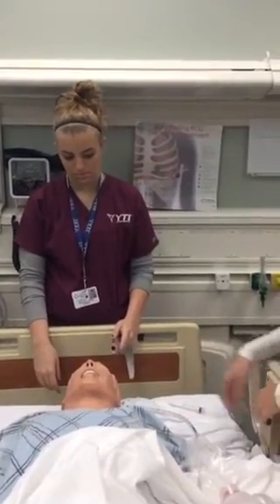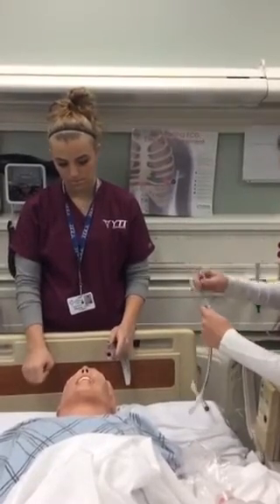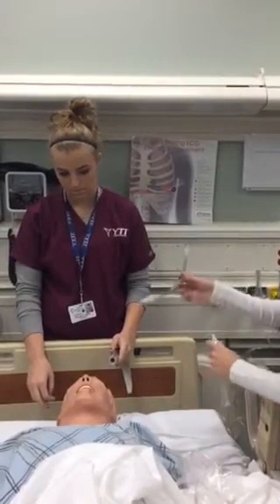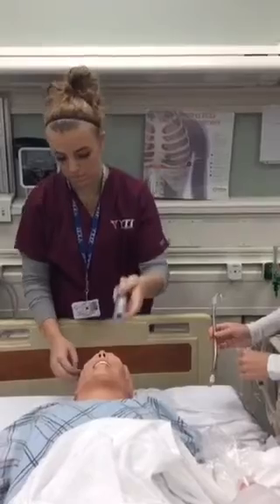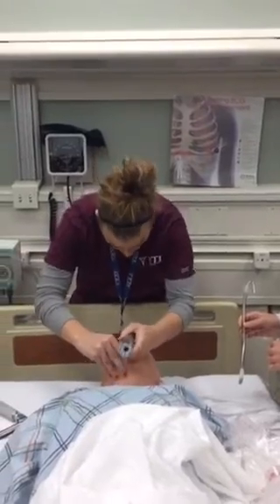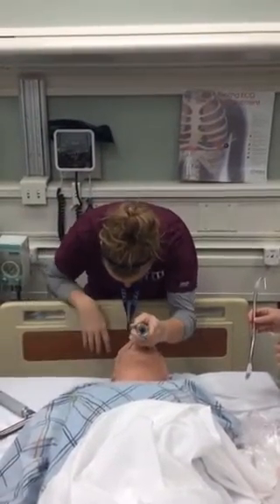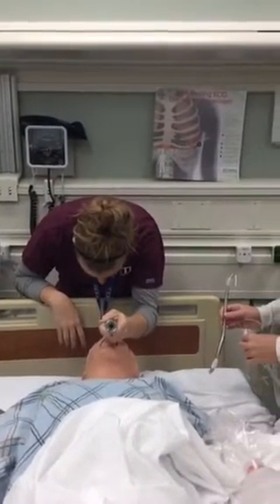Insert a stylet into the ET tube to make it more rigid for easier insertion. Make sure the stylet doesn't extend past the end of the tube. Insert the laryngoscope blade into the right side of the mouth and move the tongue to the left. Advance the blade forward. The curved blade should be inserted between the epiglottis and the base of the tongue.